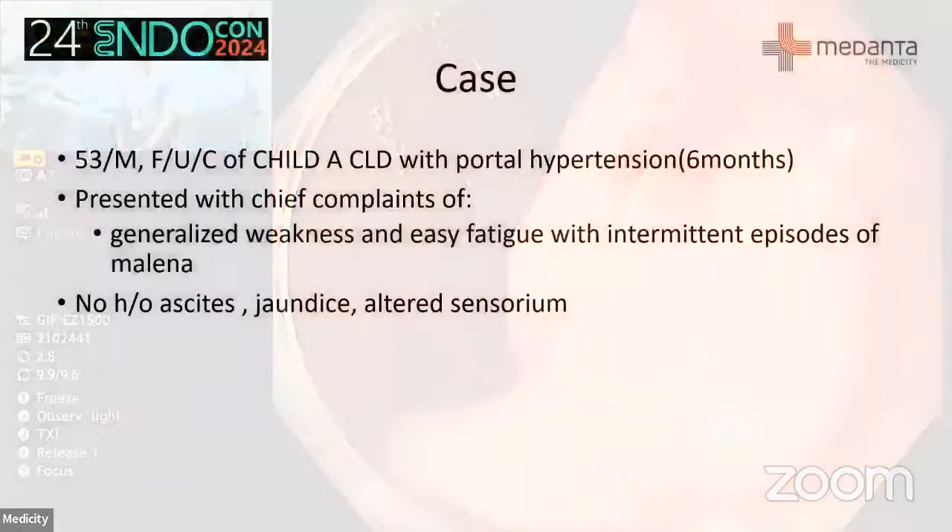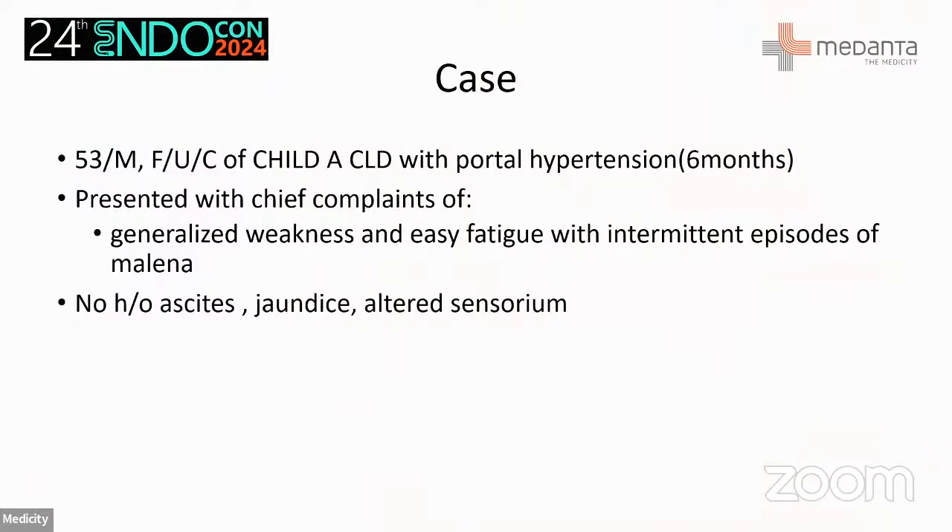A 53-year-old male with child cirrhosis and portal hypertension who has had intermittent episodes of melena. This is the endoscopic image. The plan is to do an EUS-guided coil and glue procedure.